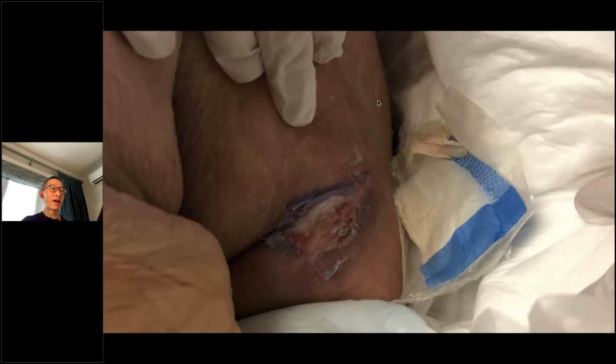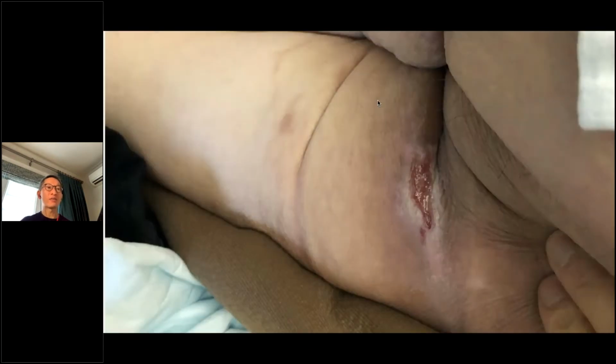Another patient with a lot of moisture issue. As you can see, we actually use a cyanoacrylate, a type of barrier, to paint over the lesion because it was constantly irritated by urine. And similar to the first case I presented to you, when the person is incontinent, the urine has a risk to get into the dressing, causing more maceration problem. So we again use the Mepilex Flex material, and the idea is to create a sealed environment, prevent moisture problem, and understanding that microclimate dysregulation is the primary reason for pressure injury to occur.